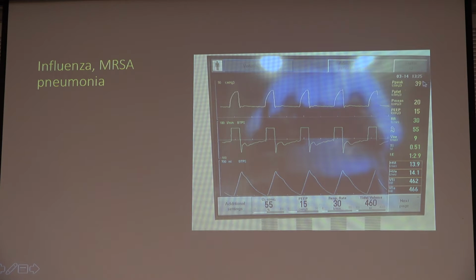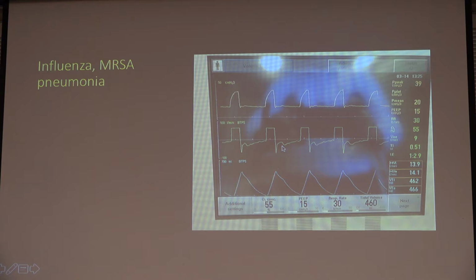So pressure's 39, so higher than we like to see, you bet. Trigger asynchrony, you bet. By trigger asynchrony, you're seeing this right here that says, I'm trying to take a breath here. This is a subtle difference, and it may just be semantics. Because of the location of this patient effort, right at the end of inspiration, we're actually going to call that a different type of asynchrony, but it certainly is asynchrony.